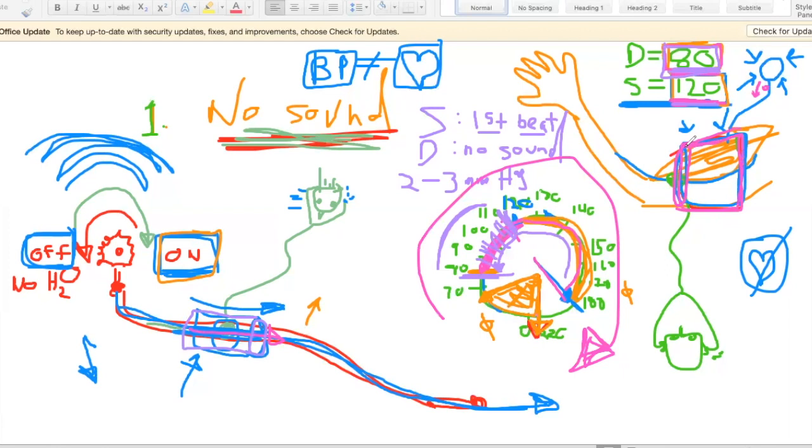You want to have a way of estimating how high you would set the pressure in the sphygmomanometer so that you don't have to overly add air into the cuff. You don't want it to be uncomfortable for people. So the way to measure it is, without the stethoscope, this is how to estimate it. You don't need the stethoscope.